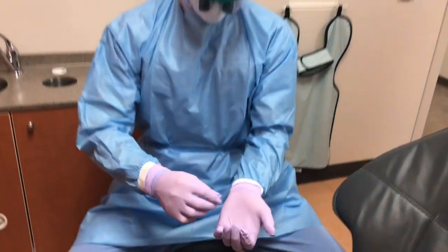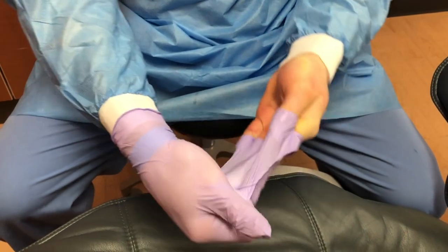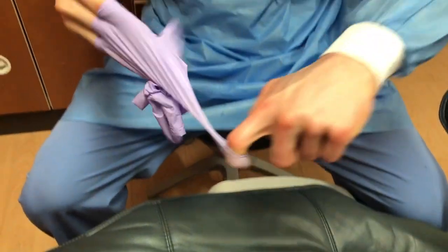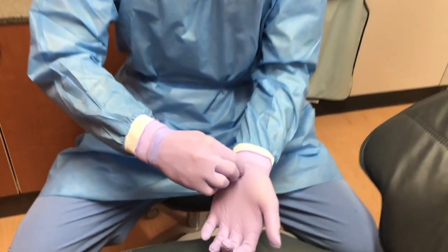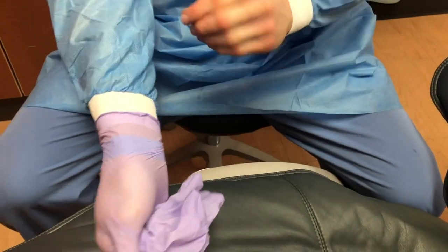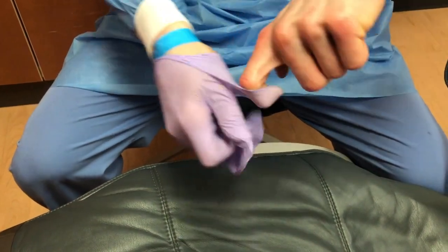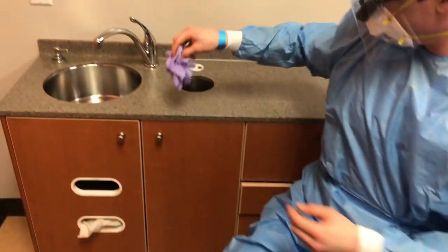There are two acceptable techniques for doffing or removing PPE. In the first, you remove the gloves first, avoiding touching the outside of the gloves. The first glove is removed by pinching the palm area of the glove and pulling it off. The second glove requires that a finger be inserted underneath the wrist and the glove is peeled off without touching the outside.